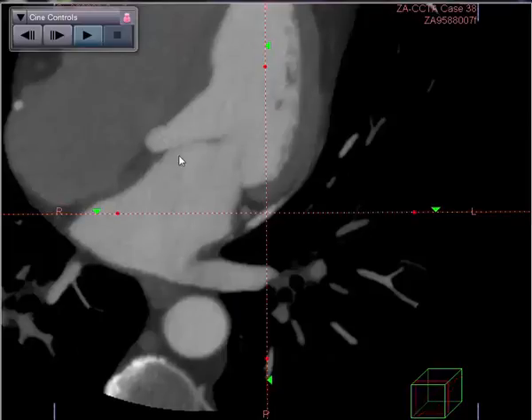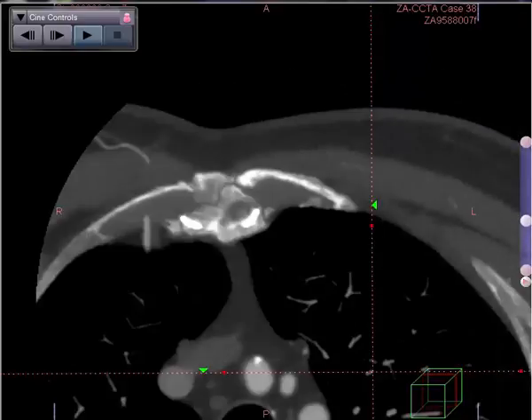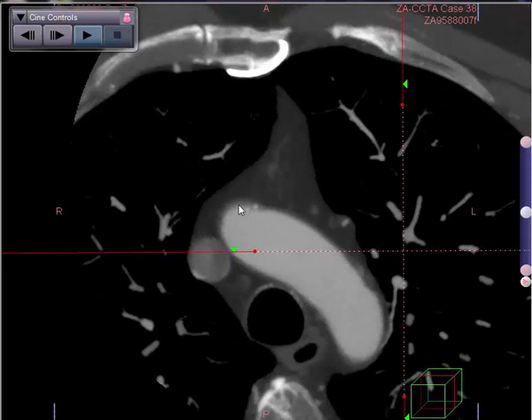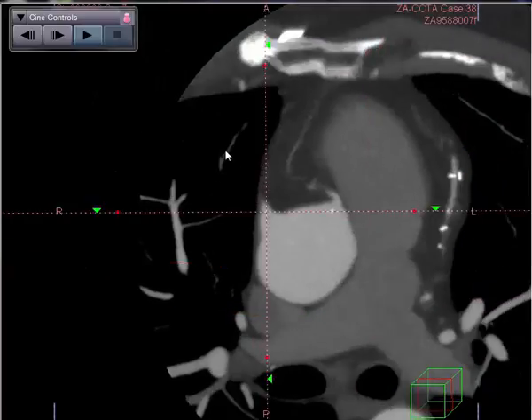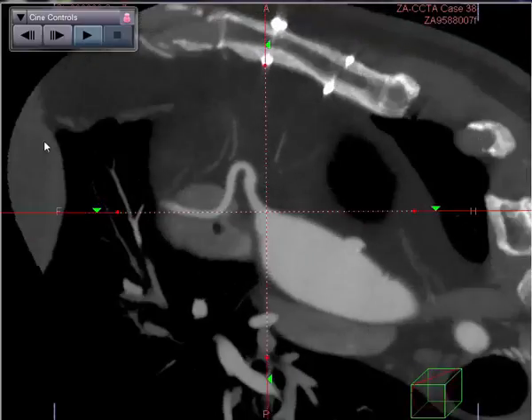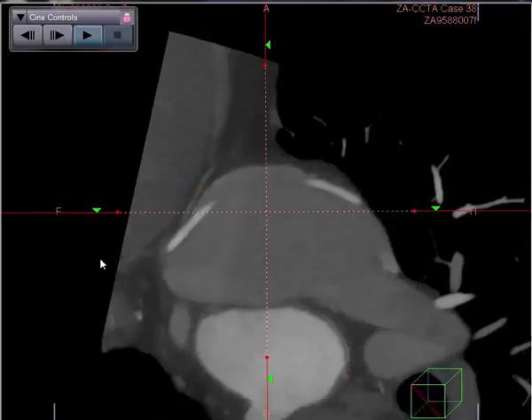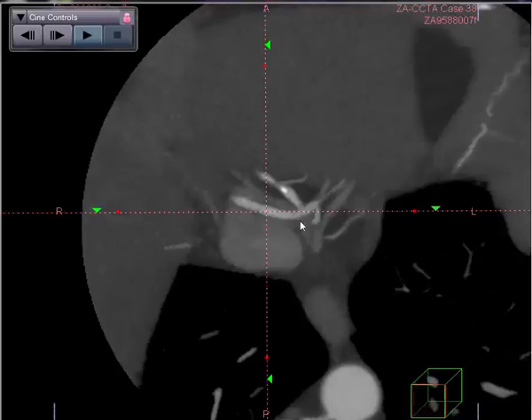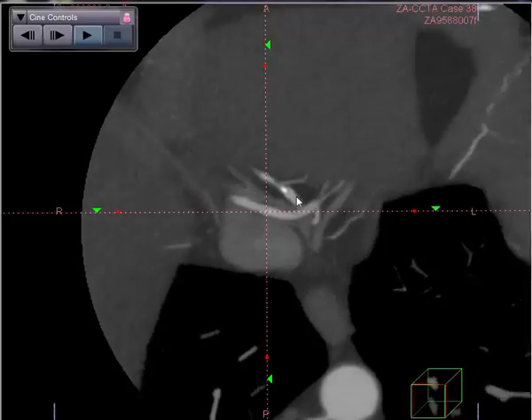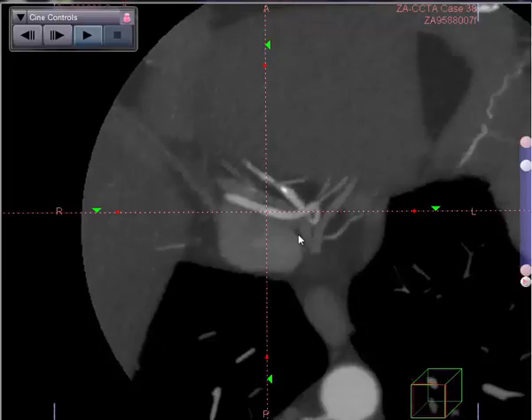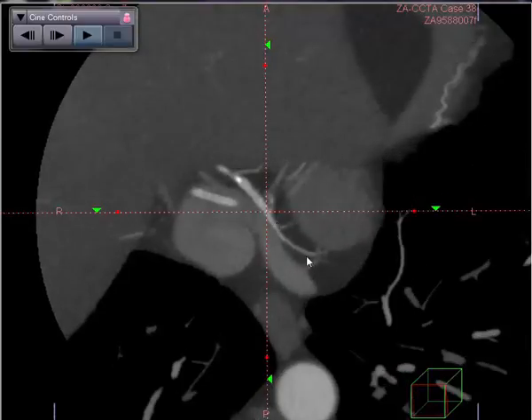Finally, let's take a look at the right bypass graft. Going back up to the region of the right coronary takeoff, you can see the bypass graft coming off right here. We can follow this around — a very normal-looking graft all the way down to the foot view, where we can see that it feeds directly into the posterior descending. There probably is some possibly retrograde flow from the PDA back into the region of the distal right coronary and also down into the small but adequate flow into the posterolateral branch.